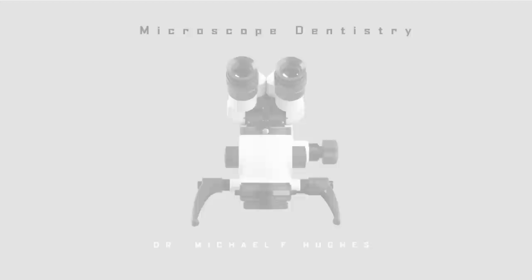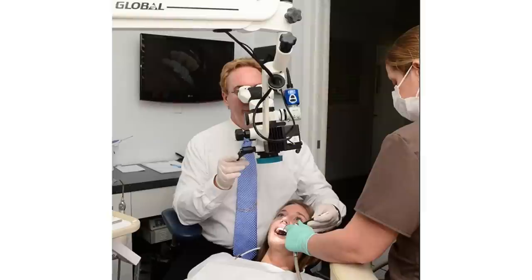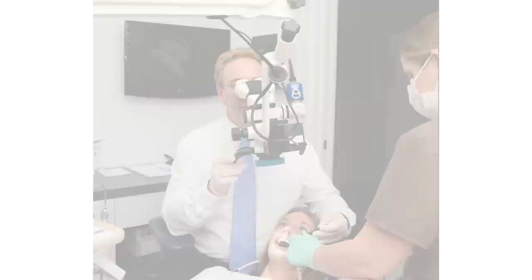This is Dr. Michael Hughes. Let me introduce you to the dental operating microscope. The microscope is suspended above the patient and has a beautiful LED light source that shines directly through the line of sight, and also six steps of magnification ranging from 2.5x up to 22x.